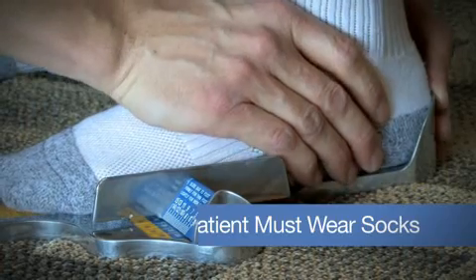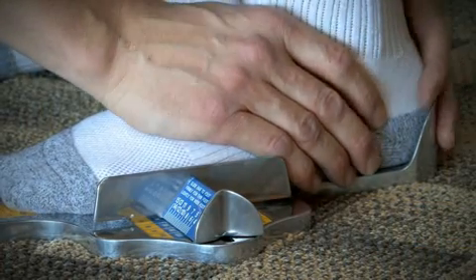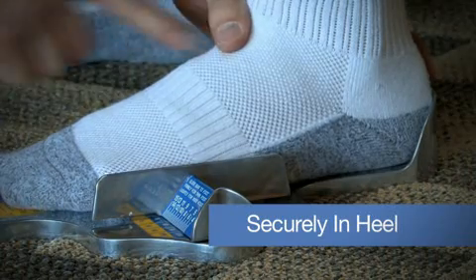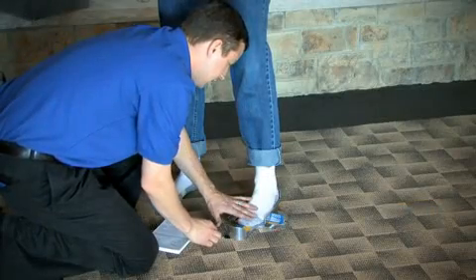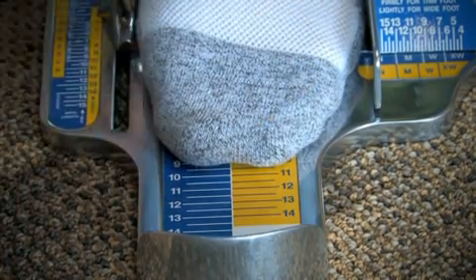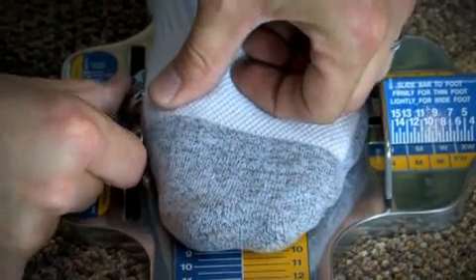Once he's back there, again, make sure he's securely in the heel of the Brannock device. Then we're looking for our measurements. The first one is heel to toe. So we look at that heel to toe measurement. In this case, he measures a true 10. We go to the heel to the ball, and we're looking at that one.